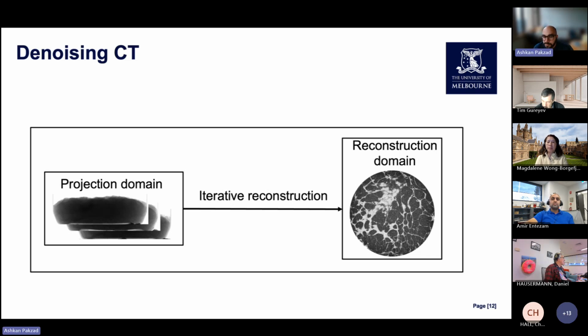It was seen before deep learning, it was what appeared to be the most typical approach, however, it was associated with being slow. And you can denoise in your final reconstructed images, which is ultimately the domain of interest in CT, where the data is more compact.